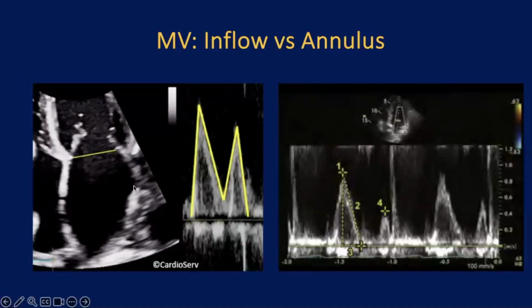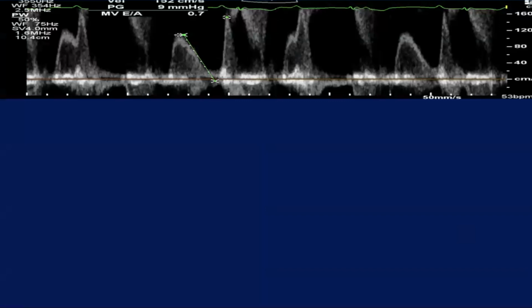And this is the difference between when you pulse the mitral valve annulus and the tips, because usually at the annulus, you will still have continuous flow. You can still have it if the patient is a bit tachycardic, but usually at a normal heart rate, there will be space between the E and A, and it should be low or no flow. So always be careful when you do the pulse wave and your measurements. Whenever the waves are funny looking, have a look at the rhythm.